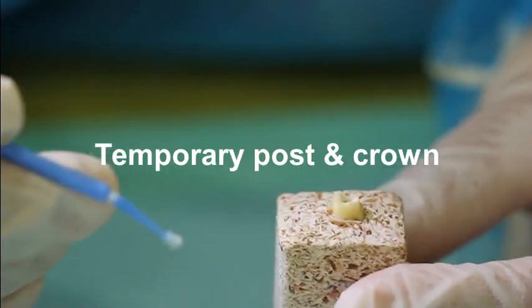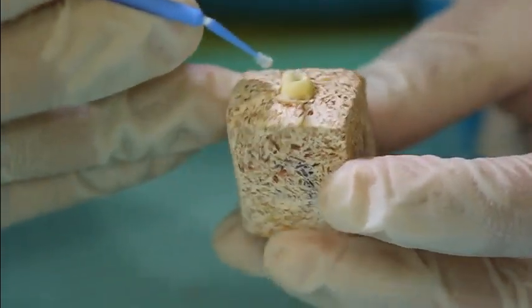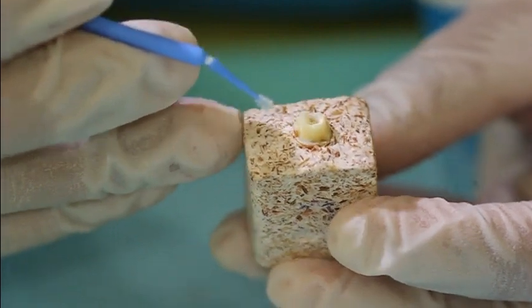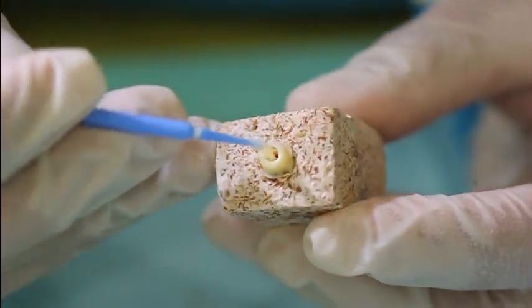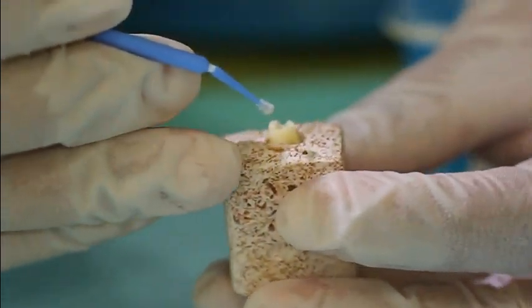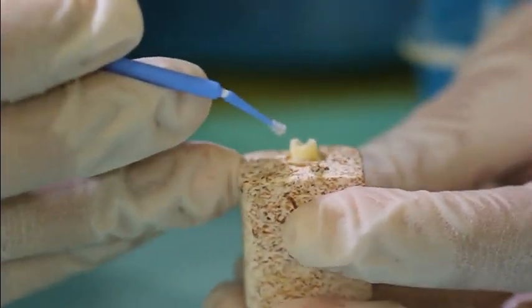Okay, now we are going to show you how to make a temporary crown with a temporary post. For this kind of case, you cannot leave the patient with a temporary crown without having a temporary post inside the canal. Otherwise, your crown will not last.